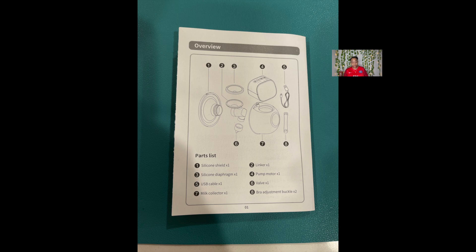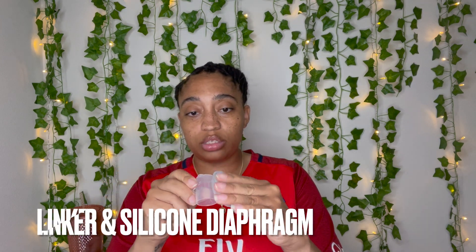I'll show you what it looks like — I do use it so it's not all put together, but it's pretty simple to assemble. You have your normal pump and this piece goes like that. The duck bill — you have to put it at an angle because it does sit inside of the shell. When you put it in it fits back into the two little notches, so you snap this part in and make sure it lines up into the notches perfectly.